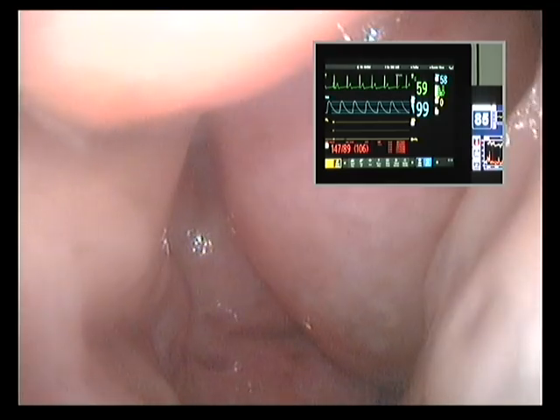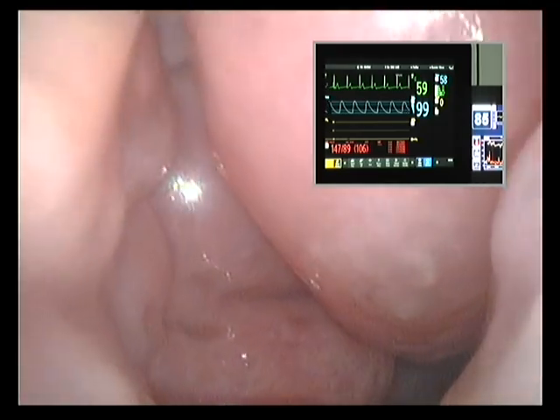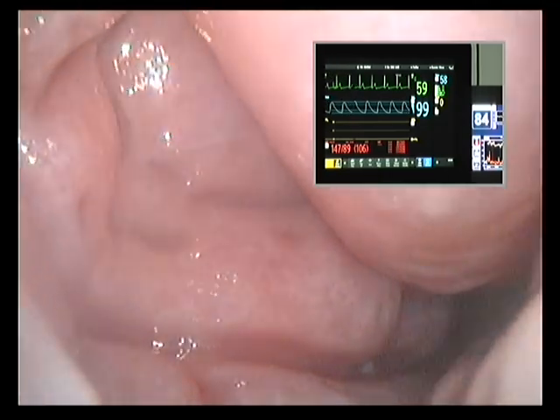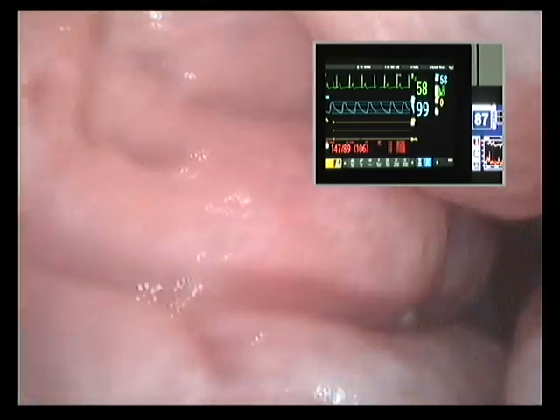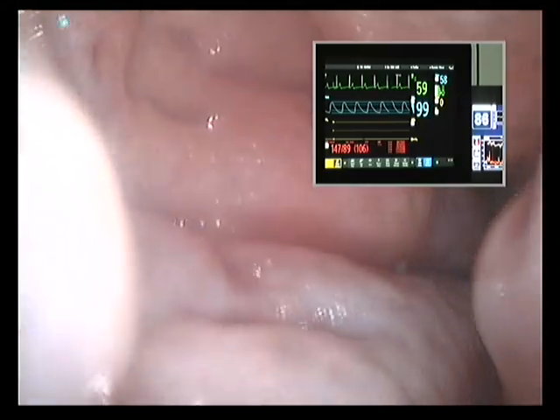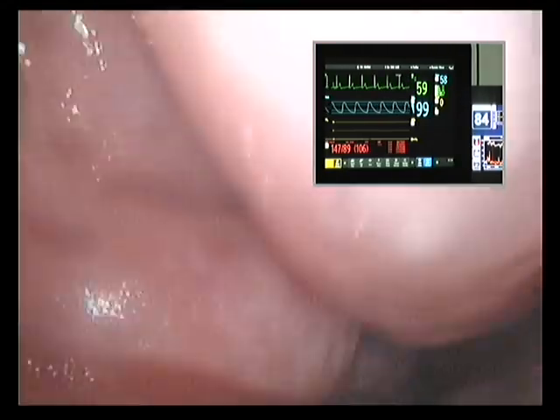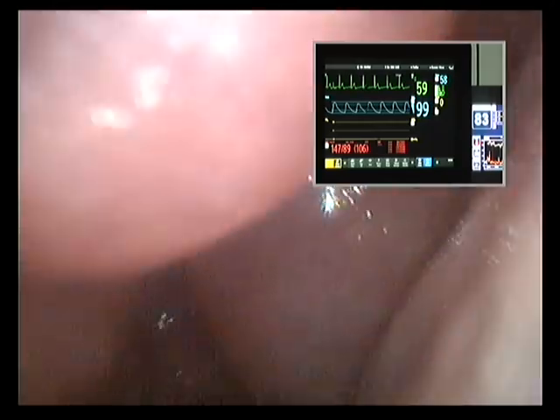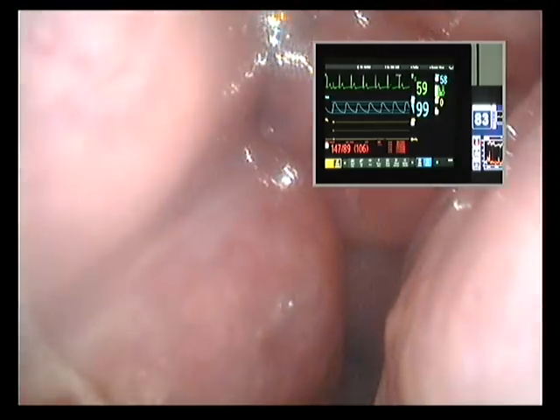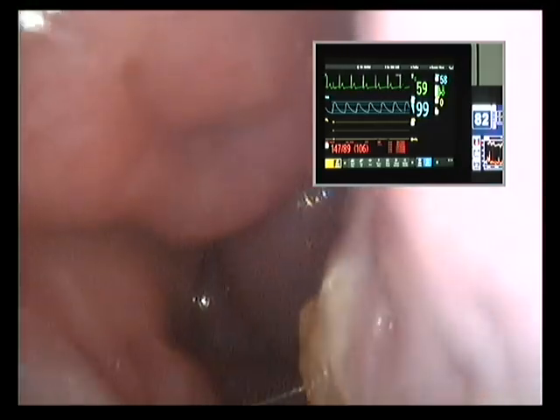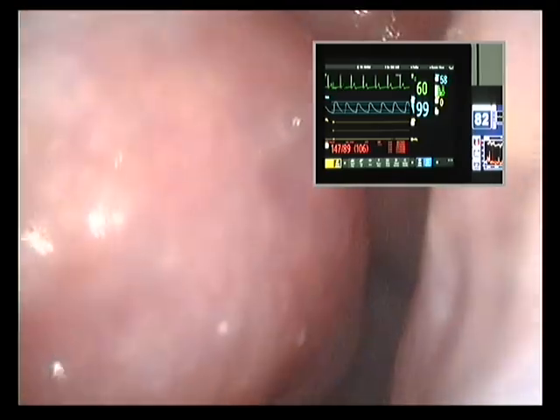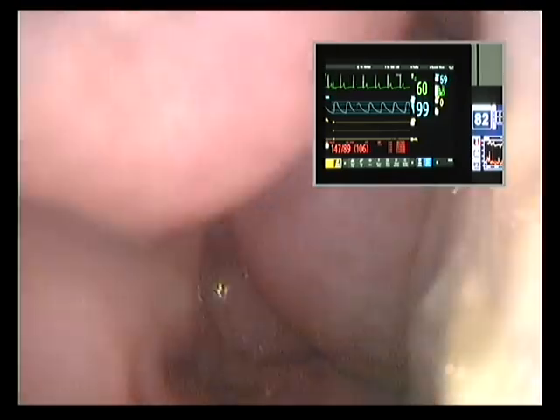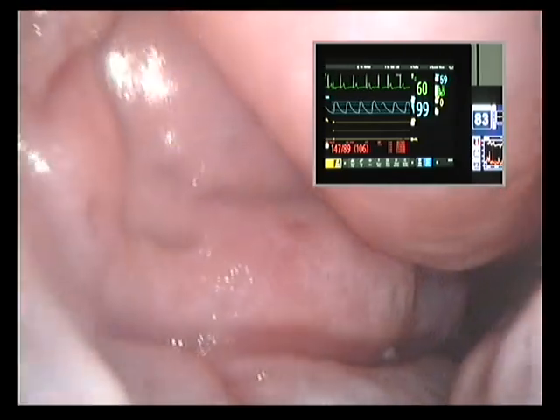I am going in from the left side. This is the deviated septum. This middle turbinate is also pretty polypoid. This is the compensatory hypertrophy of the septal mucosa — almost a septal turbinate — and the inferior turbinate. So we can see there is a lot of obstruction on the left side as well.